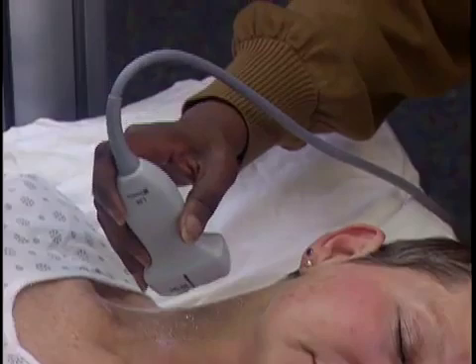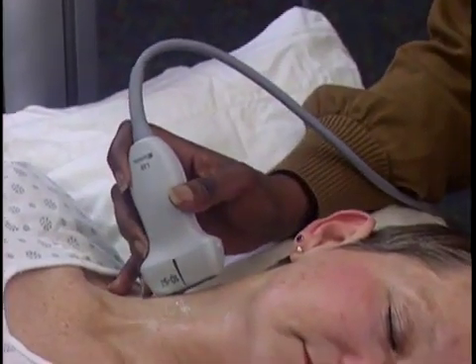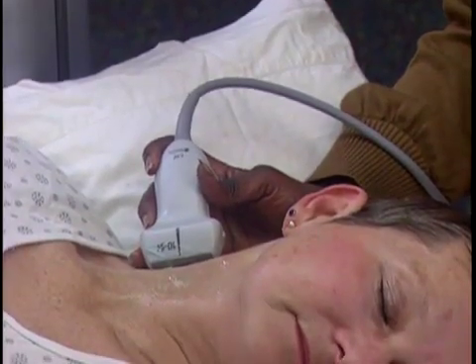In summary, the carotid CIMT exam is a bilateral exam. You want to be sure to evaluate both sides of the patient's neck and come from as many angles as possible — from the anterior approach, the lateral approach, and the posterior approach on both sides of the patient's neck.